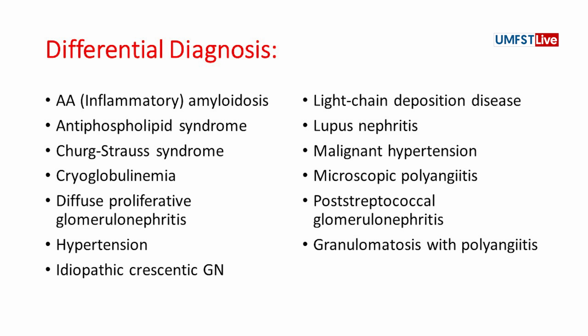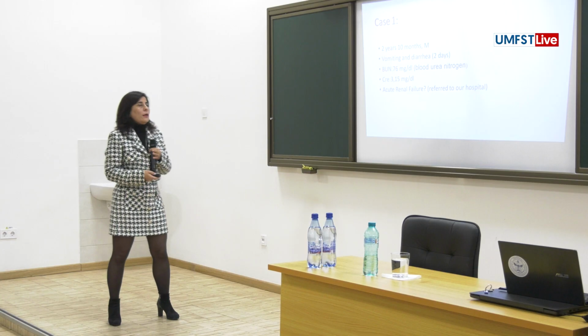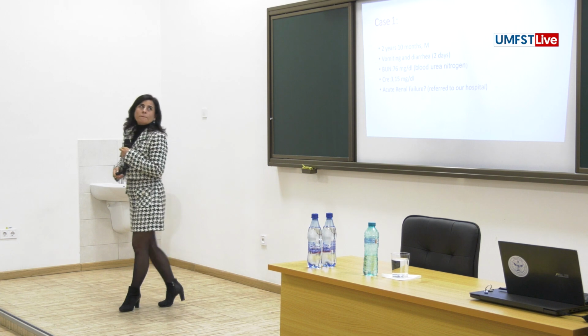Differential diagnosis is very large. Systemic diseases also make crescents. That's why it's not easy for us to differentiate this. We usually use big algorithms and look at many cases, but luckily, if you have a connection with a nephrologist, it's easier for you. I have an example case.